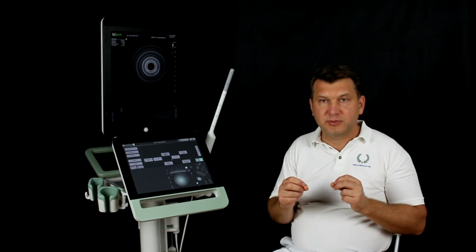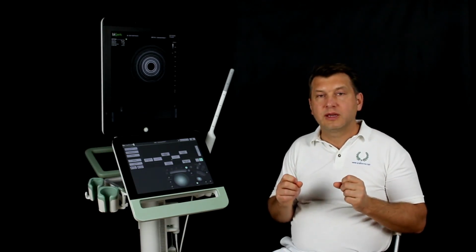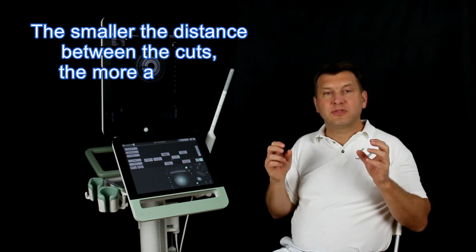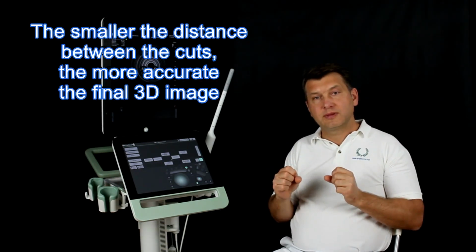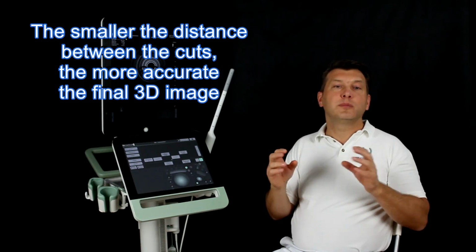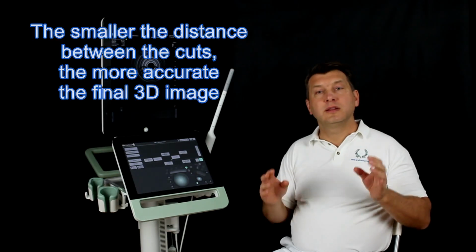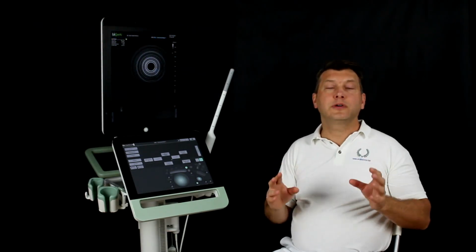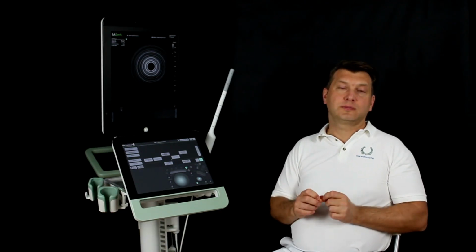The smaller the distance between the cuts, the more accurate the final 3D image. It's a big difference whether we have 10 or 300 frames in a 6 cm 3D box. The simple thing here is the more the better in terms of quality. But the more frames in a box, the longer it takes the device to obtain these pictures.